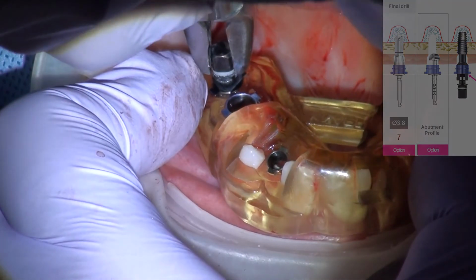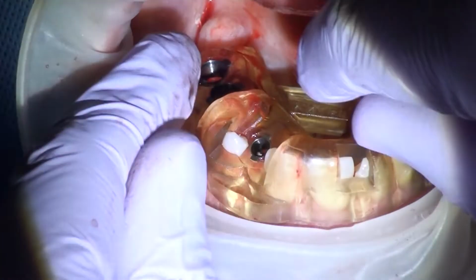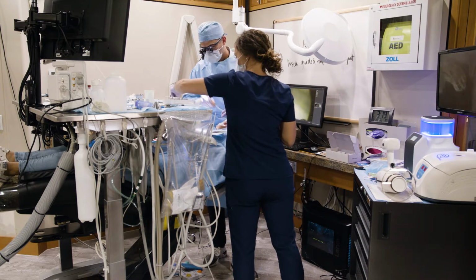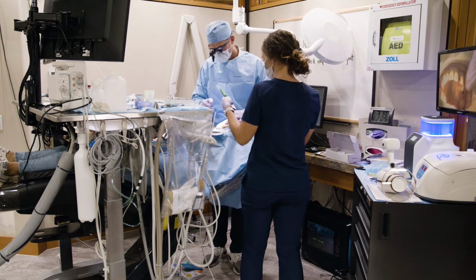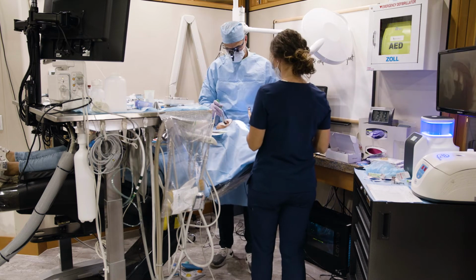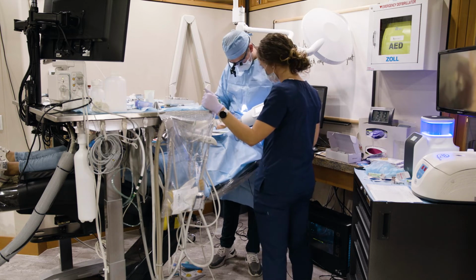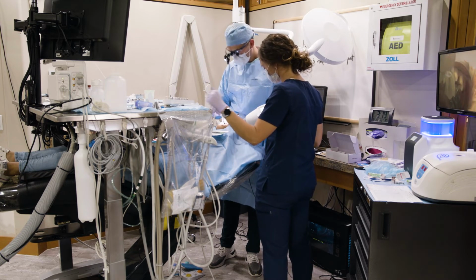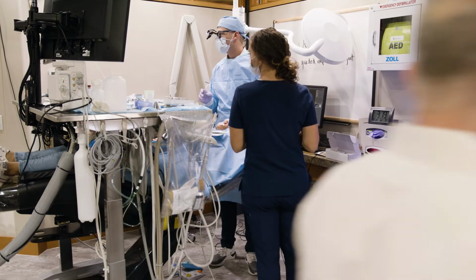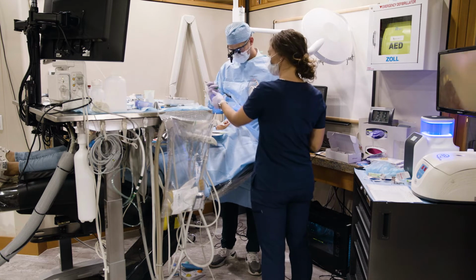I'm sorry you're feeling that. Is that some good pressure there? Let me do one more. I want to get just a little higher.